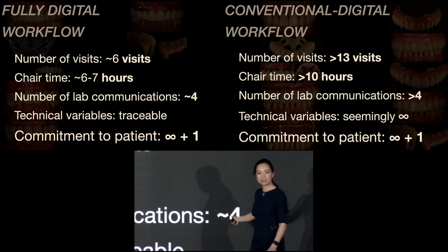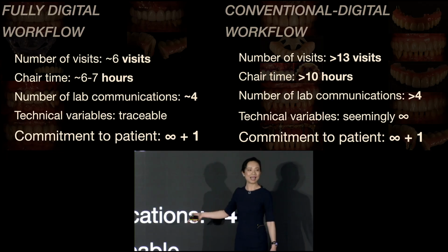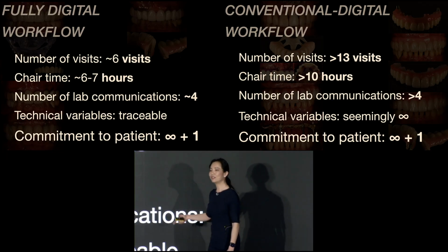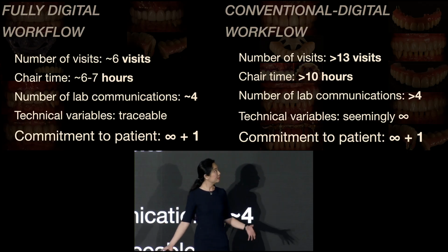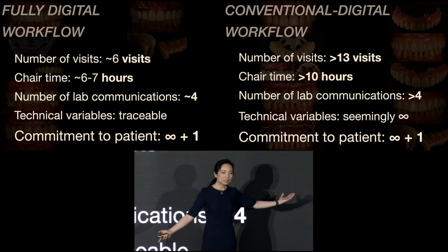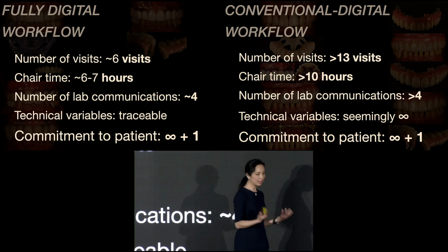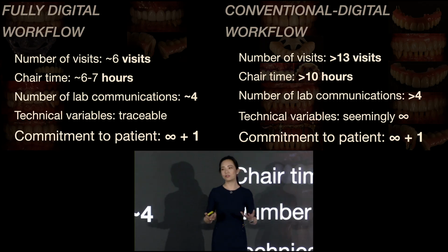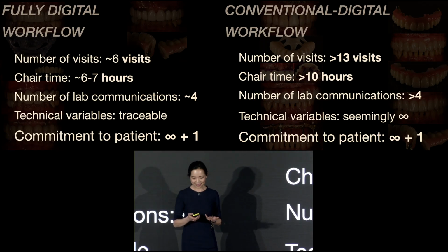Number of lab communications still stays about the same, but we can actually trace where things happened, because we can go back and look at each design and go, what happened here? How can we improve upon it? Meanwhile, within the conventional workflow, they're still subject to way more variables. And at the very end of it all, we're still fully committed to the patient to ensuring that they have the best outcome possible.